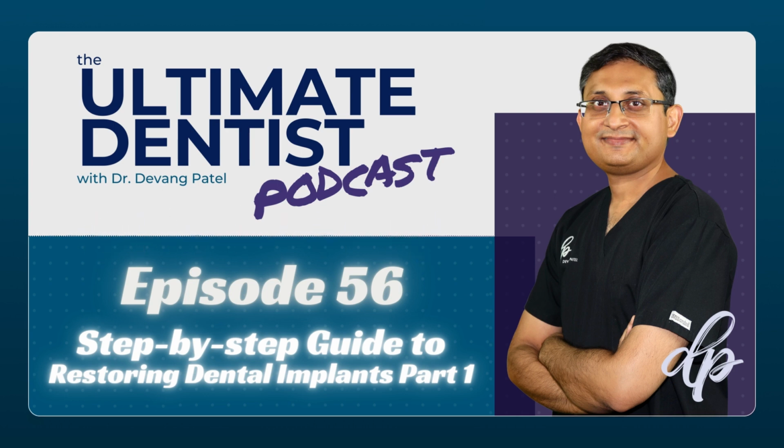The second factor is treatment alternatives. You need to really consider alternative treatments. An implant is not always the right option for one particular patient. I always give the advice that if a patient is missing one central incisor, ideally a Maryland bridge or some sort of adhesive resin-bonded bridge is a better suited option than doing an implant for a central incisor, lower central incisor, because generally you don't have to.